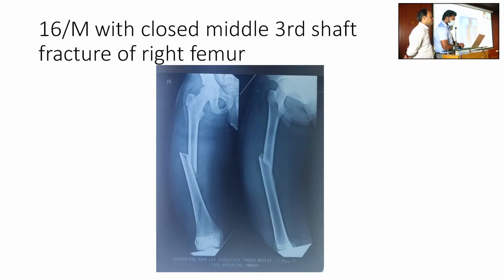What is the build of the boy? It's medium build, moderate build, sir. All right. So what complication do you expect? Suppose you put the nail now, the patient will come out in about 1 year. If the trochanter is involved or damaged, we can. You have not done anything with the trochanter, no? You're going to piriform fossa only. The circulation is lost there. Every chance of getting avascular necrosis is there in future. Vascular. Right.